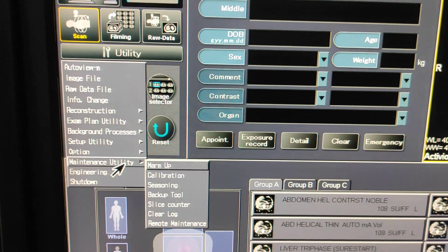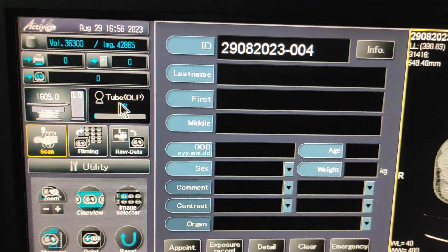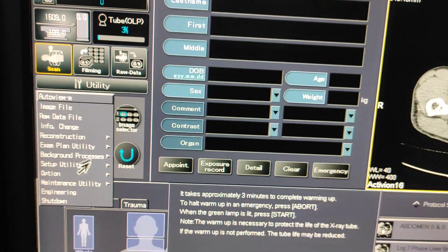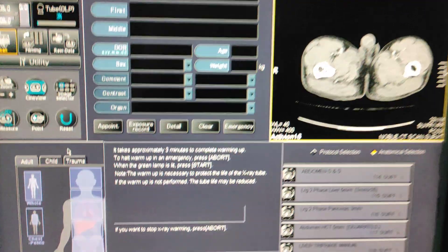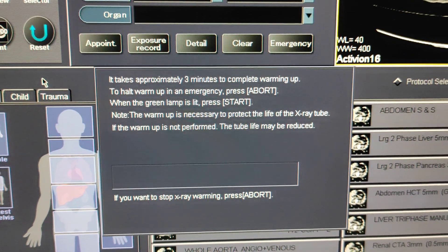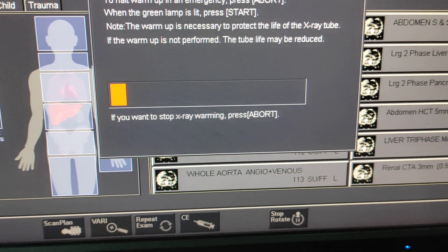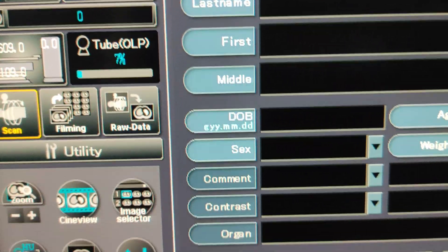Click on the Maintenance Utility and warm-up. Always check the tube OLP before scanning any patient. After clicking on the Maintenance Utility warm-up, this light will blink and you have to start. It takes approximately 3 minutes to complete the warm-up. Always complete this process before starting any scan.